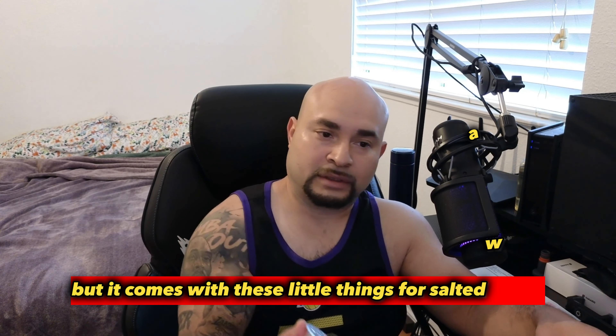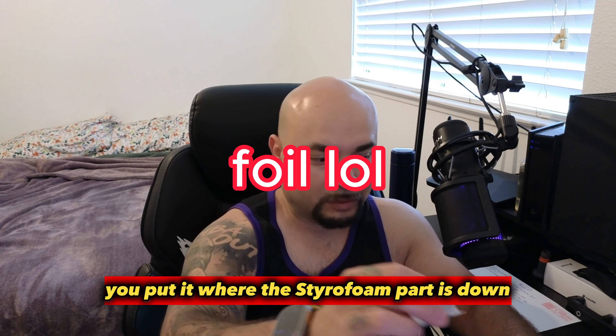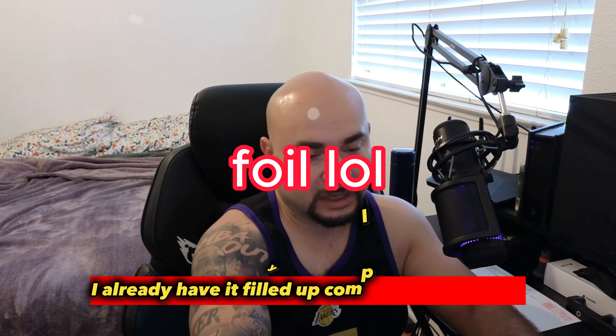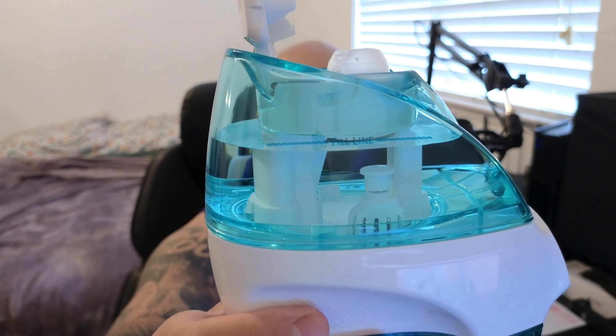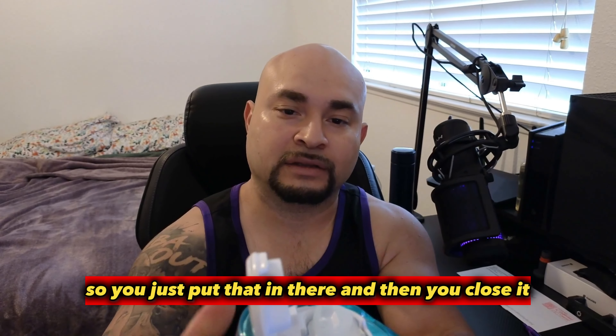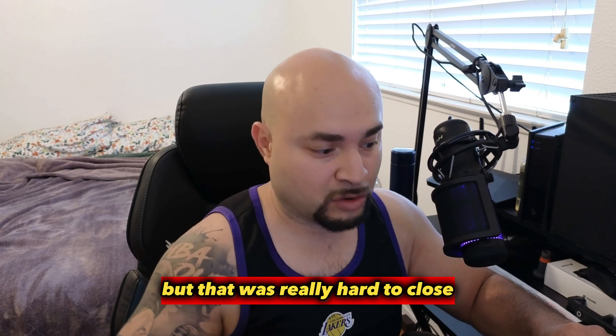It comes with these little salt pods for salted water. You put it in where the styrofoam part is down. I already have it filled up completely to the line, so you just put that in there and then you close it. That was really hard to close.